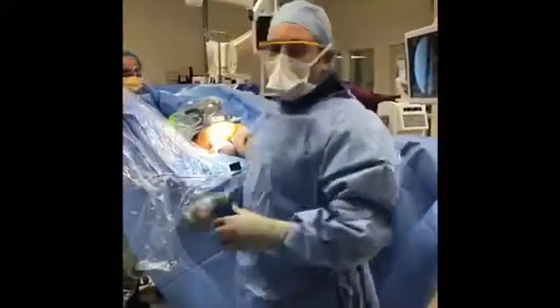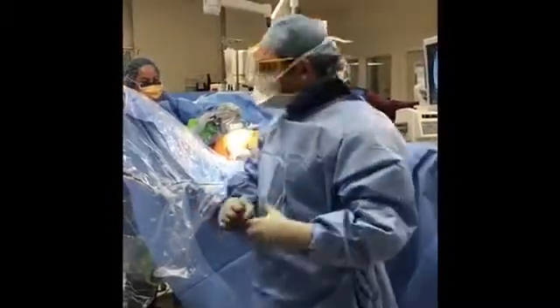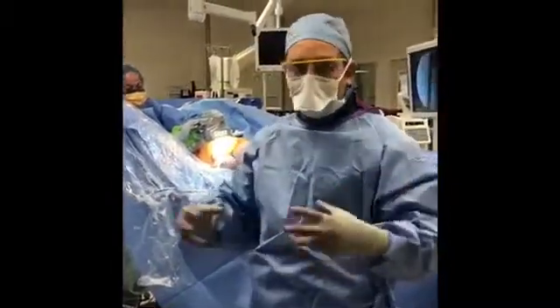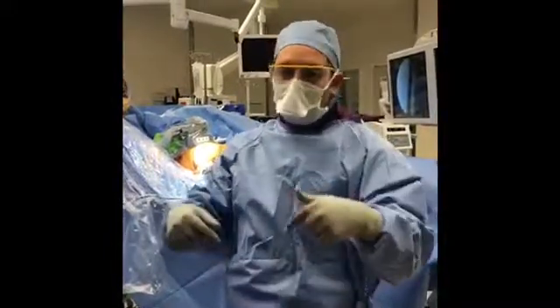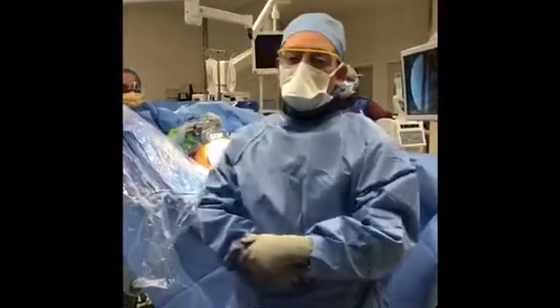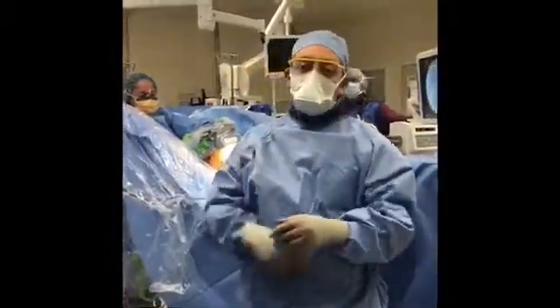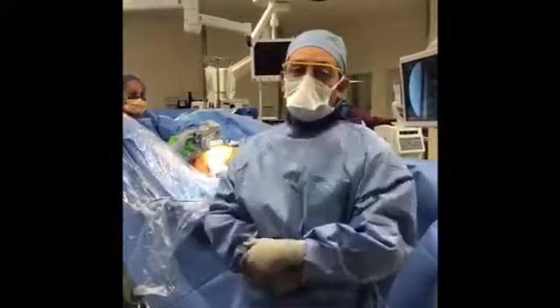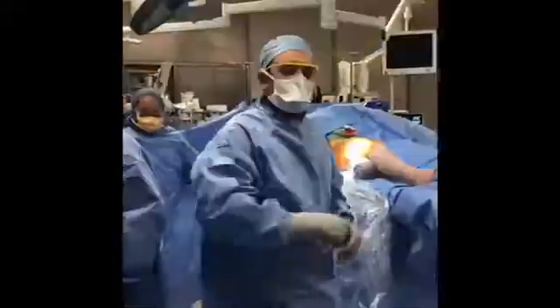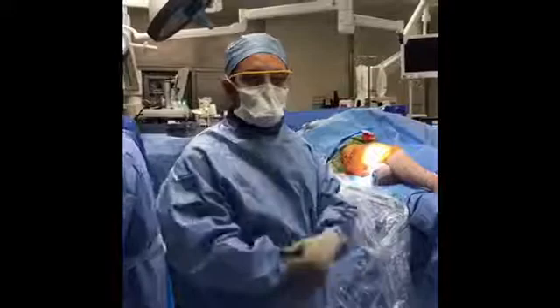Currently we're in the middle of doing the lengthening. This actually tests the nail to make sure that it's properly functioning. We're gonna give the patient one millimeter of length intraop — that's to check to make sure the nail is functioning properly. Over here there's an opening; that's where I released the IT band. It's gonna help with the patient's lengthening as well as walking more normally afterwards. We just finished lengthening the nail and confirming that it functions properly, so everything is good to go.